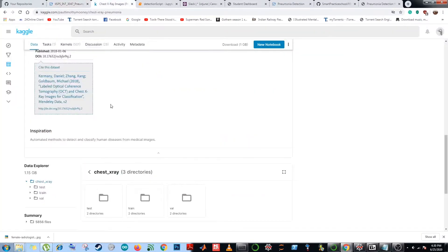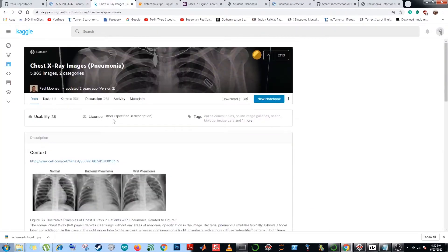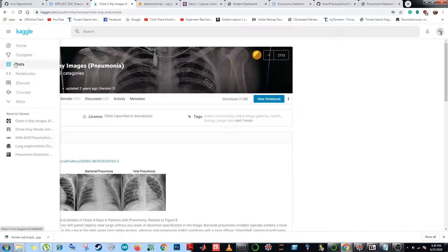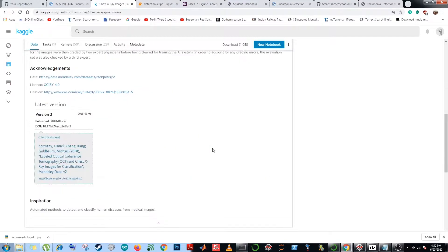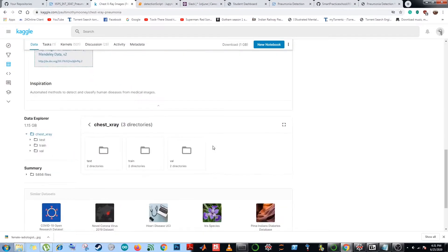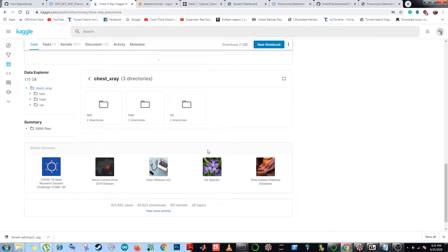Now I would like to talk about the dataset which I've used for creating this model. We have used the chest x-ray images pneumonia by Paul Mooney, and the best part of this dataset is that it is beautifully aligned for making data pipelines.